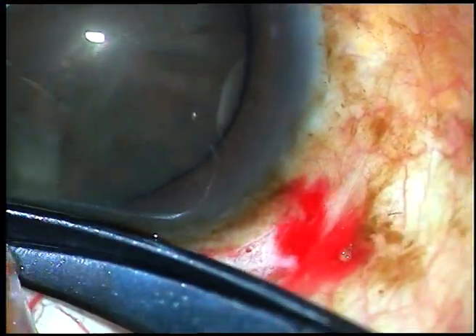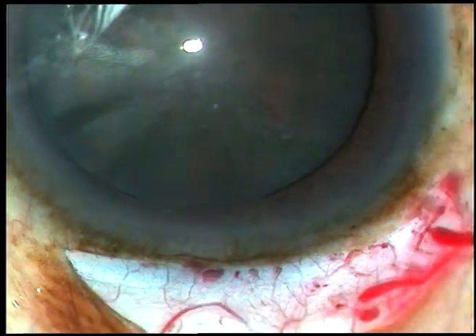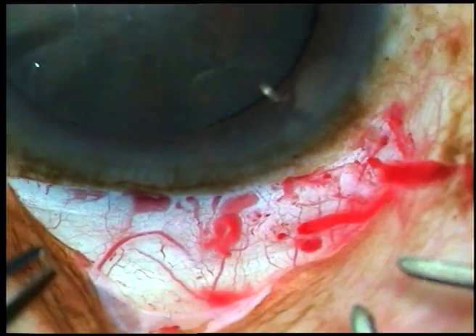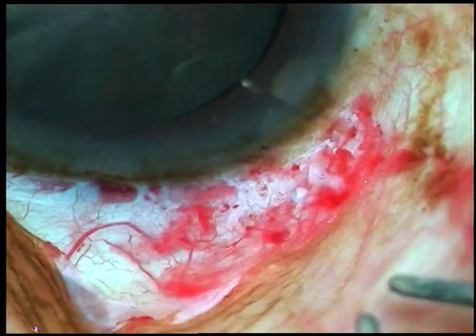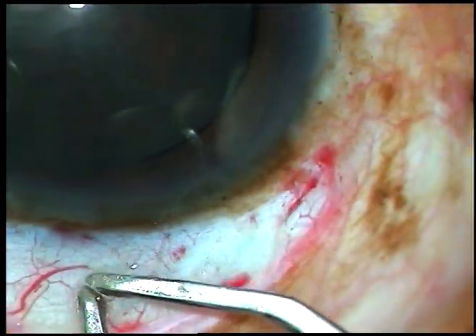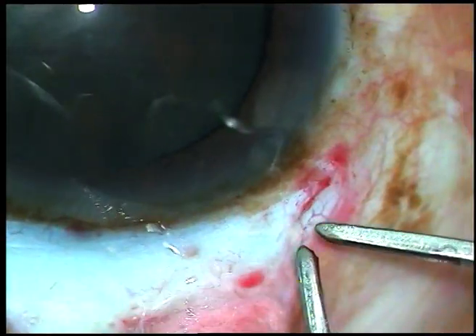This was a superior incision. Small radial cut. Then conjunctiva and tenons were taken together. Now wet-field cautery — very mildly it should be done, just touch over the blood vessels. There should not be any charring or any contraction of the sclera.